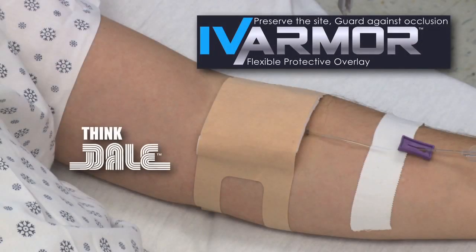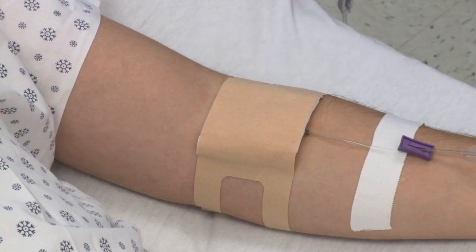The Dale IV Armor Flexible Protective Overlay preserves the IV site and allows for patient mobility while it guards against occlusion.